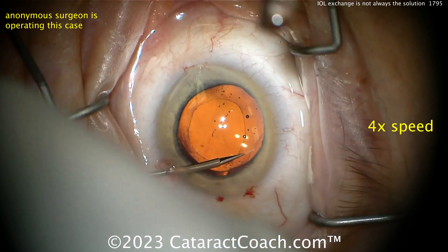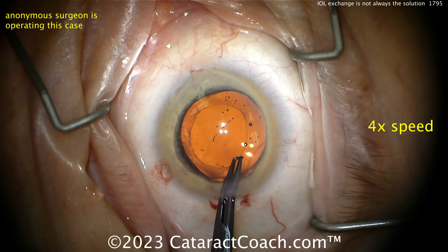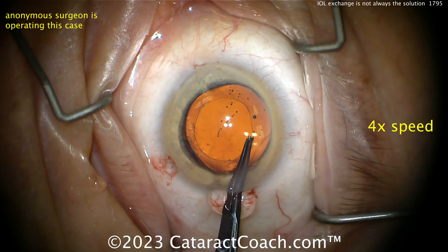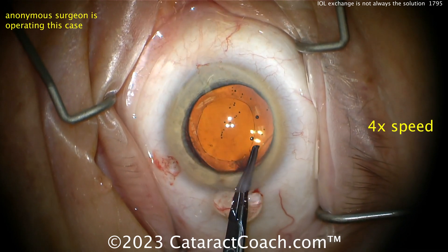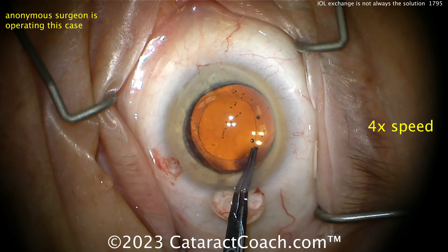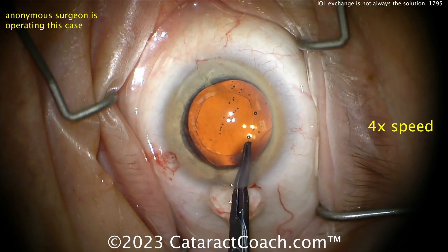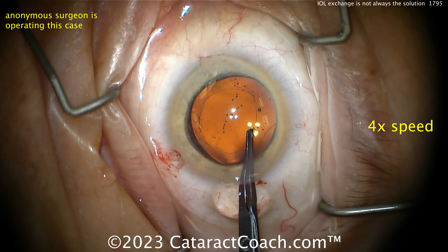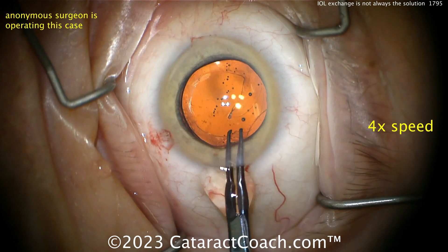Now cutting into the capsular rim, looks like trying to do an enlargement of the rhexis. There's the cutting, and now tearing the rhexis to make it larger. You probably don't need to make it any larger to be honest — these lenses are soft and flexible and you can get them out through that smaller rhexis no problem. I don't see the upside of enlarging the rhexis, at least not right now.